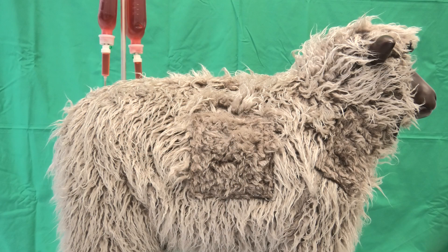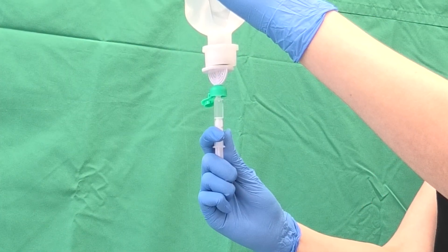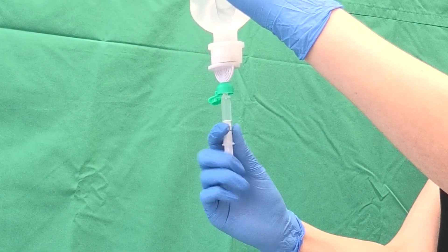First, the area is prepared and the required materials are gathered. The patient should be properly restrained in order to prevent startle reflexes from harming either person or animal. The simulator does not require restraint. The required volume of injection fluid is drawn into an adequate syringe.